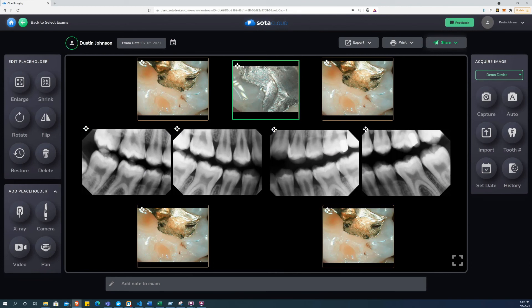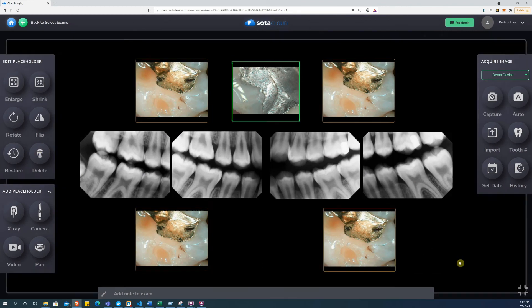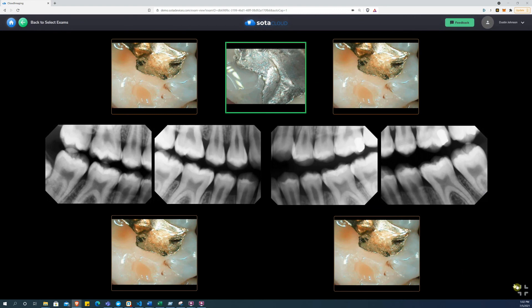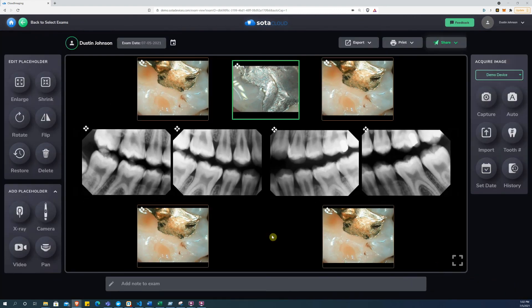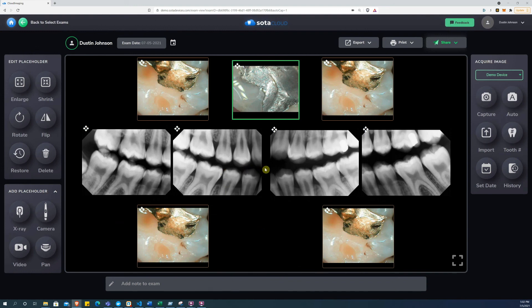Once acquired, images can be viewed all together using the full screen control, or viewed individually and enhanced or annotated by simply double-clicking on the image to bring up the image view.